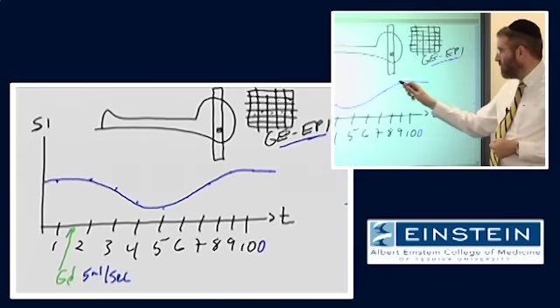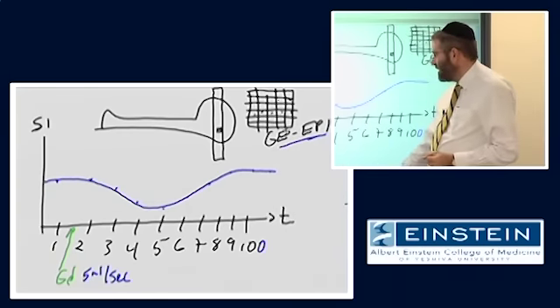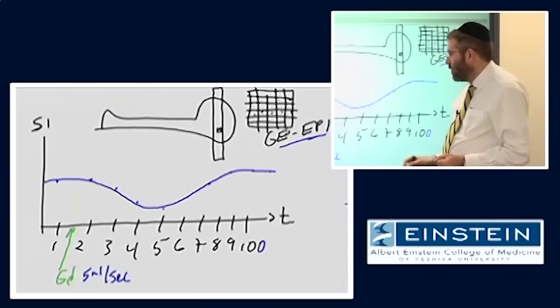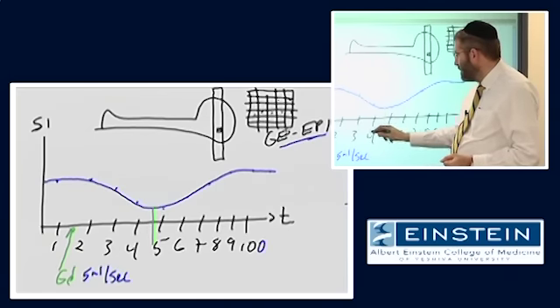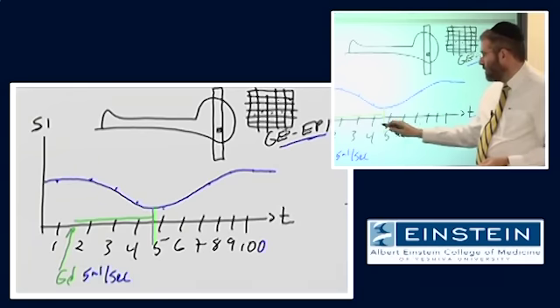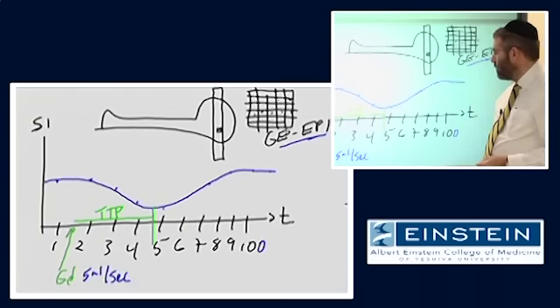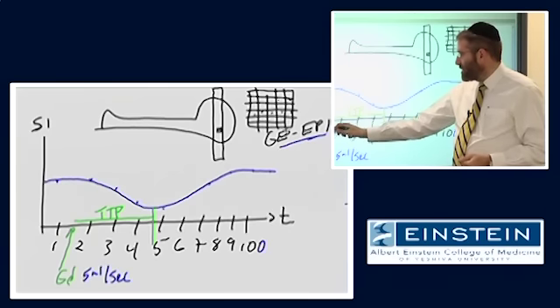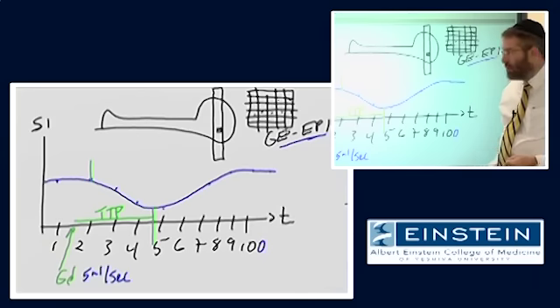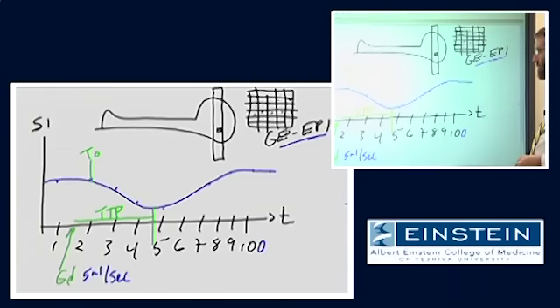Okay. From this information, we can make a whole bunch of semi-quantitative measurements of the hemodynamics of what's happening in the brain. We can look at the time to reach this maximum decline in signal, which is called the time to peak. We can look at how long it takes from the injection of the contrast till we first start to see a decline in signal, which is sometimes called T0, or is called the arrival time of the contrast bolus.